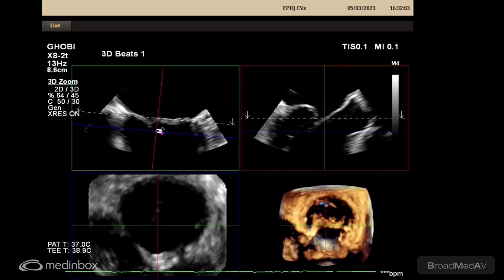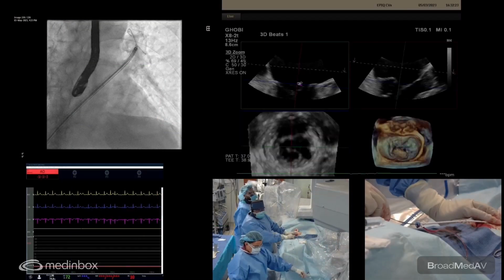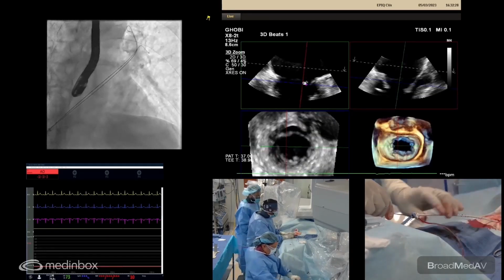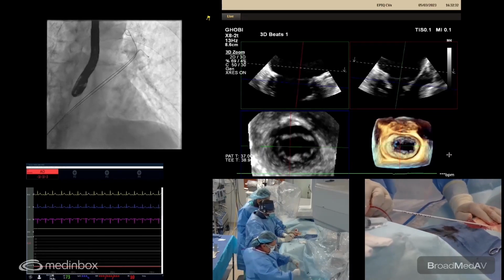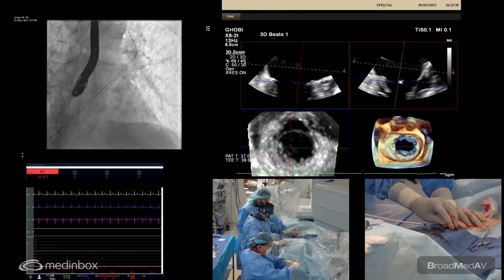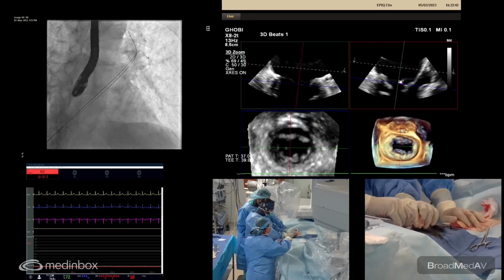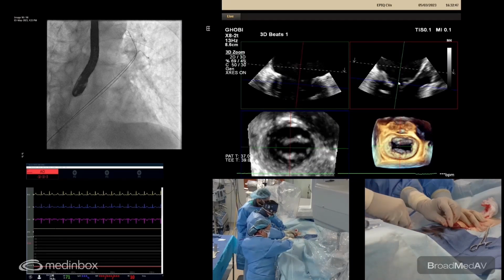All good pathology. What were the pulmonary veins like? Blunted on both sides. If I move this red plane laterally, we can see it in the bottom left full image. If we go right into the middle of our pathology, I think that's where we're going to target our first clip. Because of the width of the prolapse, we're thinking an XTW. We have plenty of leaflet on both sides to grasp here.